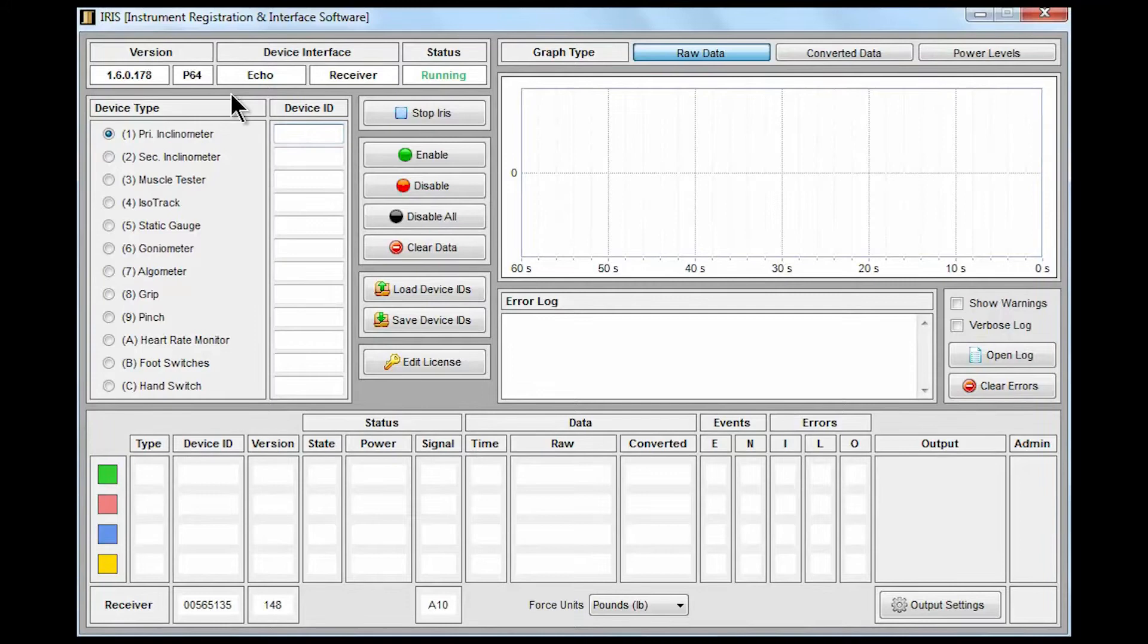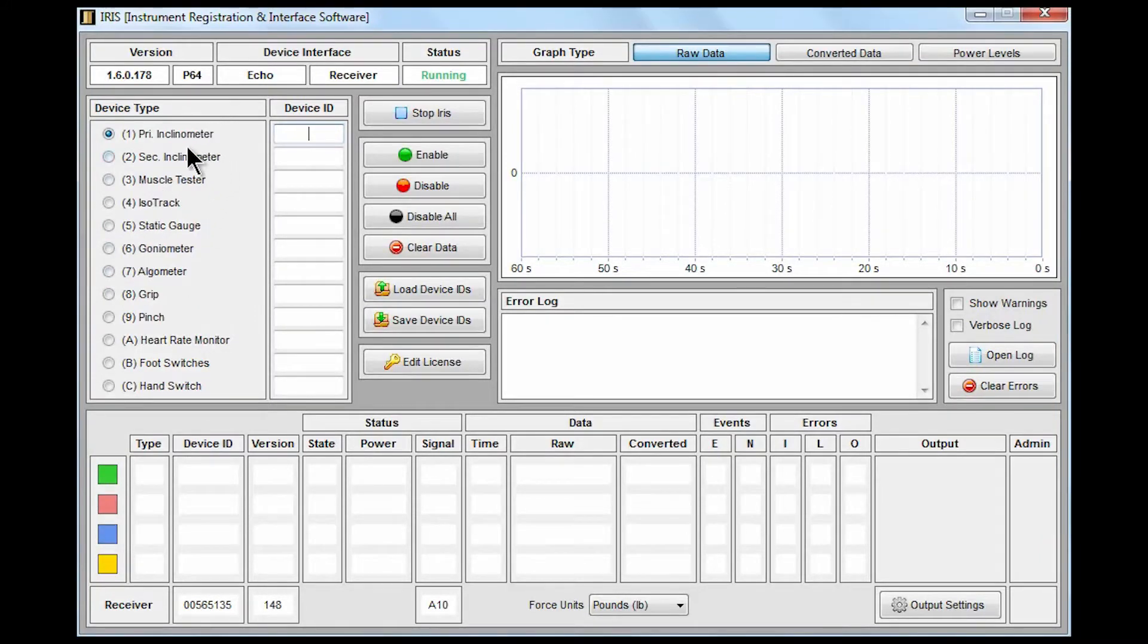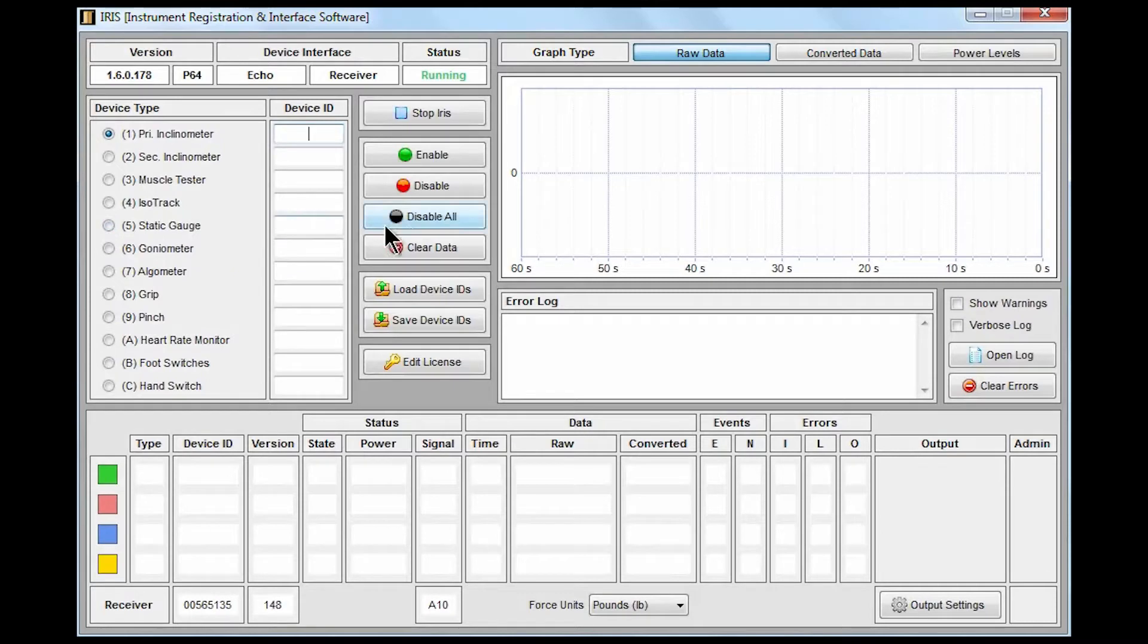In the standard interface we have on the left hand side a list of all of the JTEC measurement tools, the objective measurement tools for range of motion and strength that are available for use with the product. In the middle area we have a command bar that can be used to send commands to the devices to enable, disable, load them or erase them.